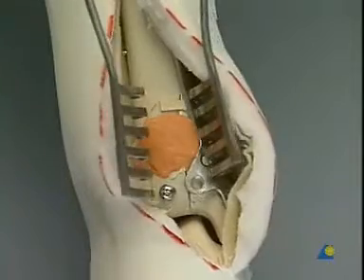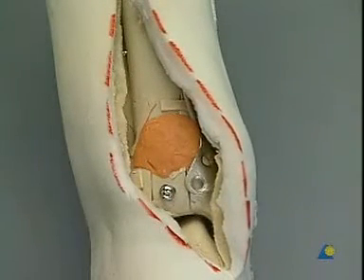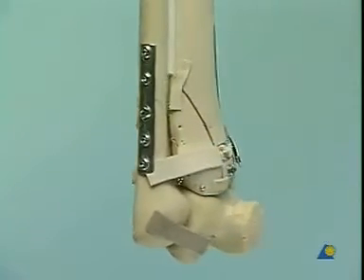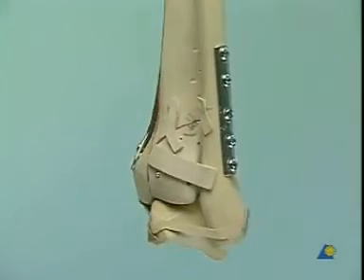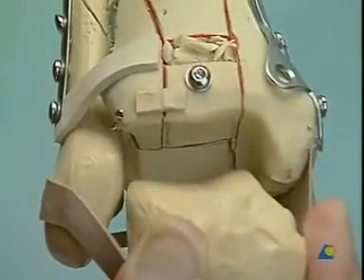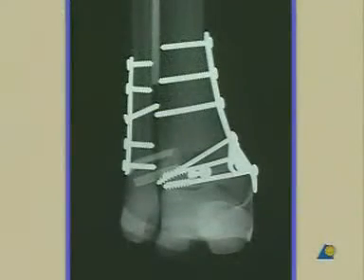The wound is irrigated and finally closed with a very gentle suture technique. Here, a closer look at our model without foam cover — this is how your fracture reduction should look. Especially inspect the reduction of the ankle joint. This is the final x-ray in AP and lateral direction.